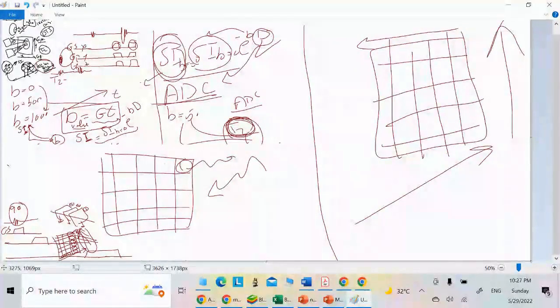This gradient includes your entire section from bottom to top. So you have all the voxels rotating during the recording, and when you record them, they send you a signal with a different frequency and phase. You can differentiate them to determine their origin from any location, and you can also know the intensity with which they arrived. The intensity depends on the magnetization.